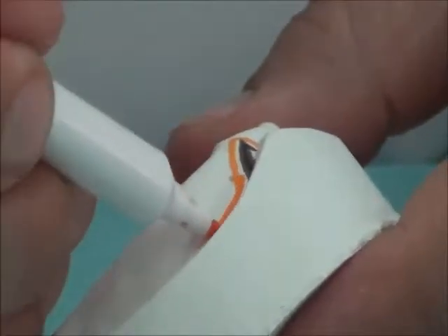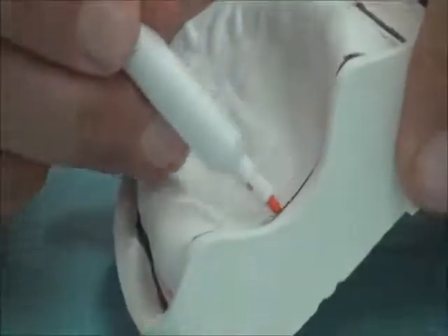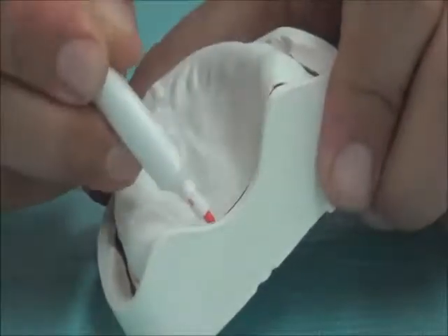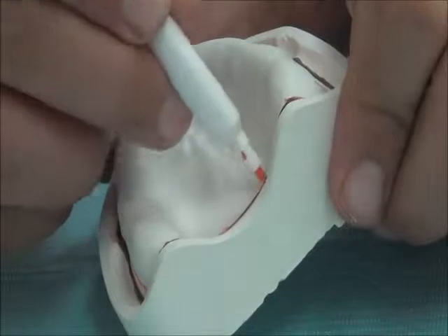Run to the other side with the same features. Freni, notches, opposite to the freni in the tissue. I go behind until I reach the far end. For the posterior area, these two lines meet. We're going to make the tray on the same line drawn posteriorly. So these two lines meet in the hamular notch area. So the tray should extend into the notch. It doesn't end on the tuberosity, it ends inside the notch, the hamular notch. So this is our outline of the tray.